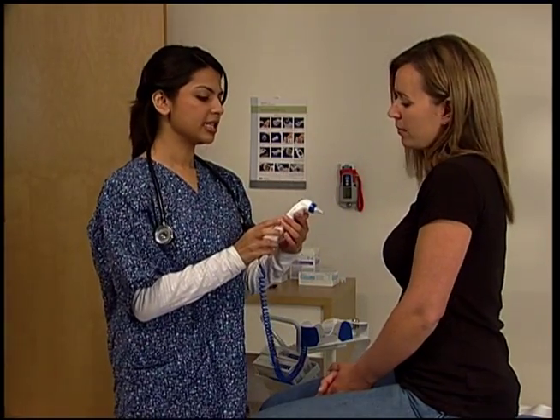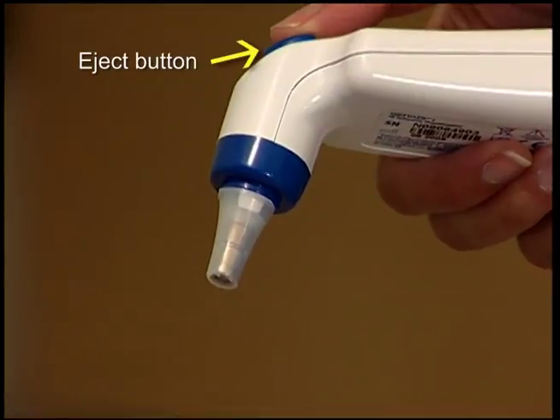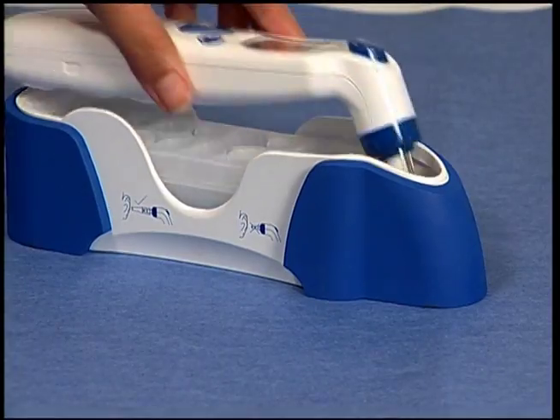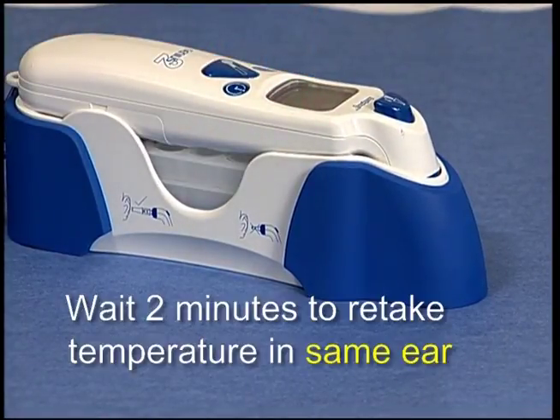Dispose of the probe cover into a waste receptacle by pressing the eject button located at the top of the thermometer handle. Return the thermometer to the base unit for storage. If you wish to take another reading in the same ear, you should wait at least two minutes for the ear to return to pre-measurement temperature.